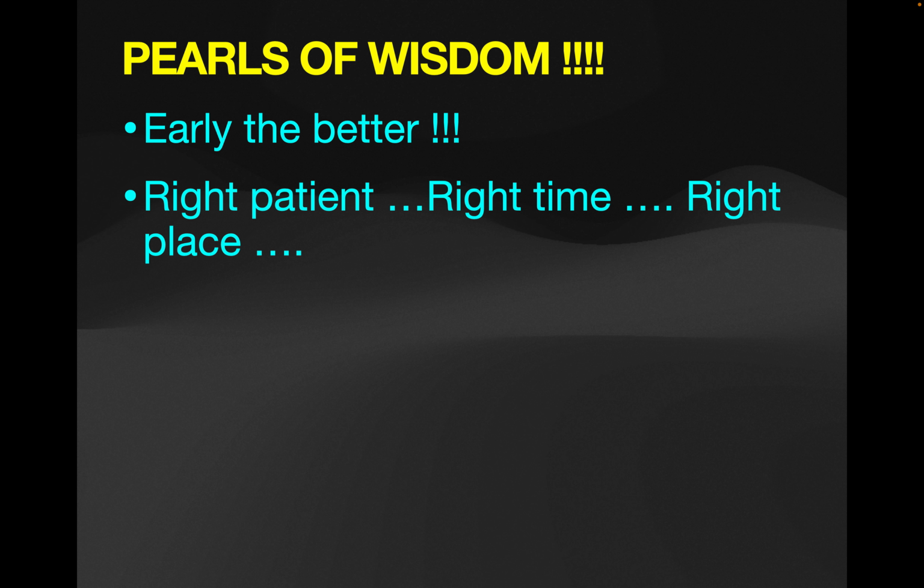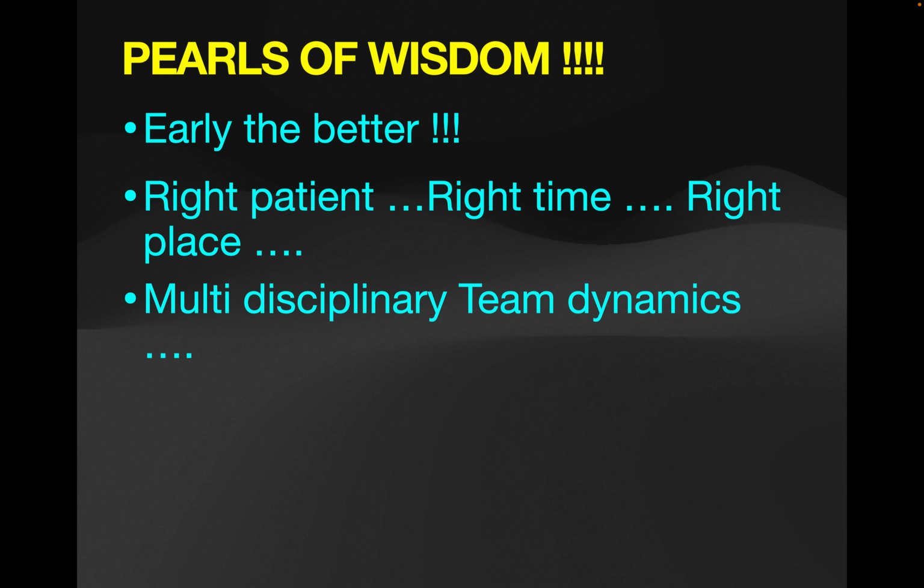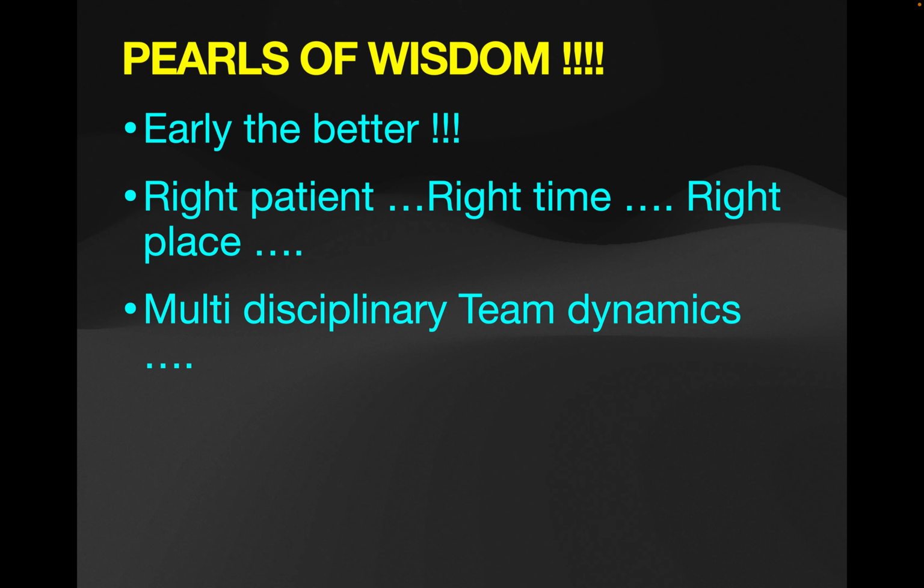I think the pearl of wisdom is: the earlier, the better. There are also criteria to consider: an initial 3 to 4 hours of hypoxia and about 6 hours of hypercapnia. You need to keep this in mind. But early is always better, for the right patient, at the right time, and in the right place. If the center is well equipped for ECMO, of course you go ahead. But if you have the slightest confusion or doubt, it is always better to shift or transfer this patient to an ECMO unit.